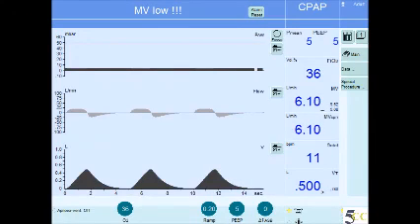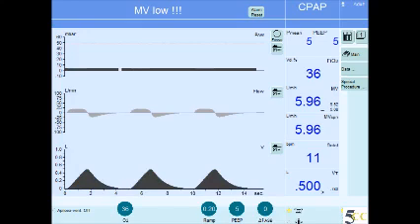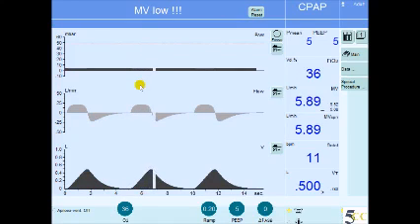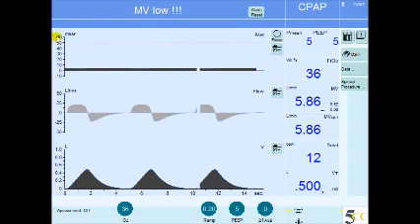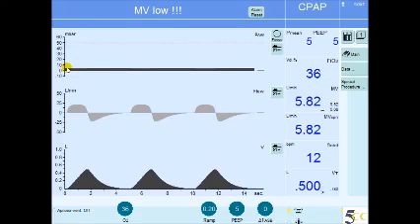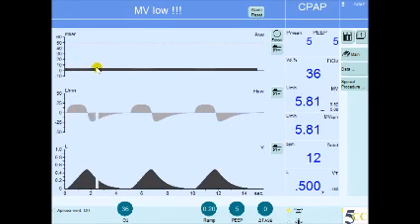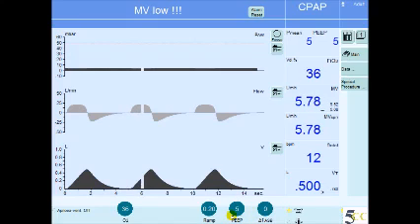Today's five-minute critical care concept is going to be about pressure support ventilation. If you have a patient who is intubated on mechanical ventilation, with a CPAP mode of ventilation, on the pressure over time curve you can see that the tracheal pressure is about five centimeters of water — that is the set CPAP level on the ventilator.